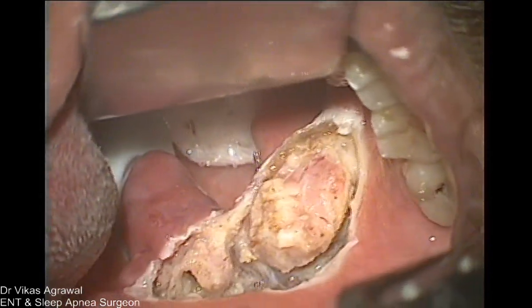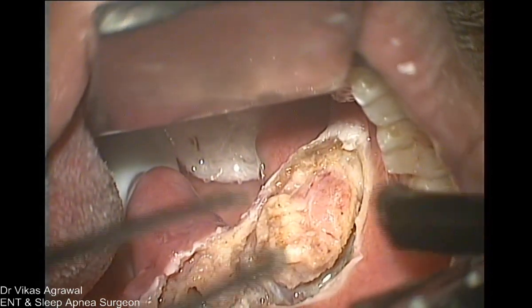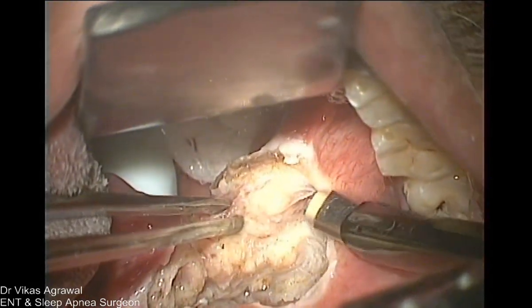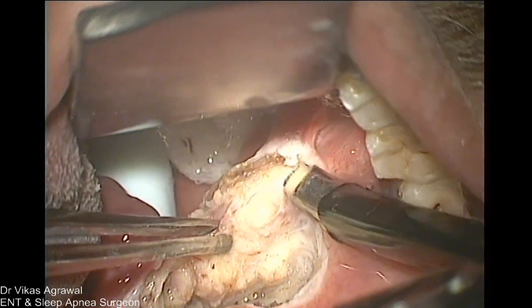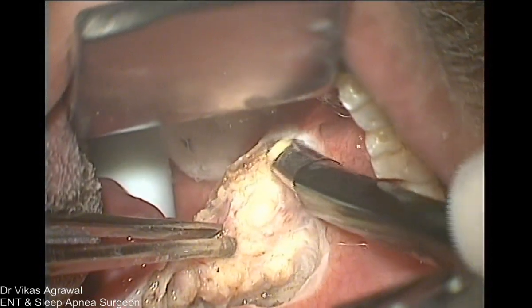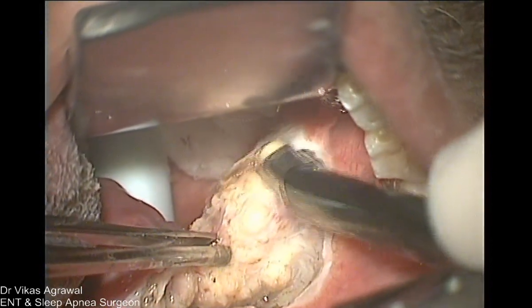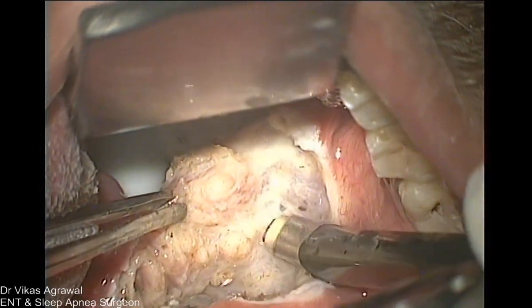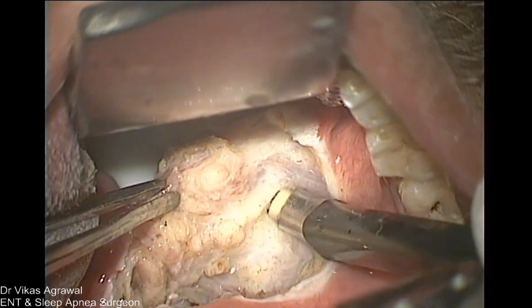I'll reposition my microscope. ठीक है, बराबर है? Yeah. Now see how huge the tonsil is, though it was not looking so big. The tonsil plays a pivotal role in the palate being pushed backwards and causing sleep apnea. That I'll explain in the talk that we are going to have.